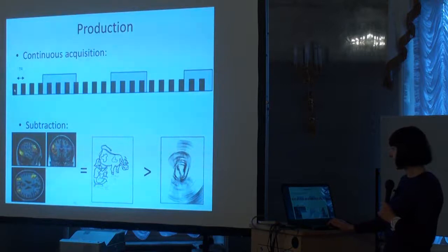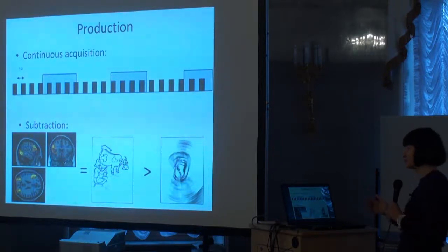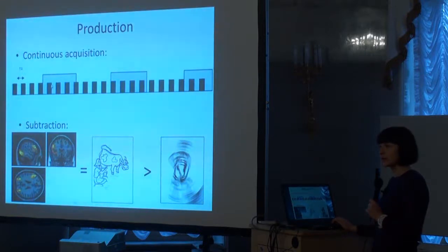So these are two different things. We can collect data every 2 or 3 seconds, and this is what produces a specific sound in the scanner. But we do it throughout the whole experiment. And this is a block of your stimuli. So they're packed in one block. Let's say 10 stimuli here, each lasting 3 seconds. So in total, it's 30 seconds of stimuli presentation.